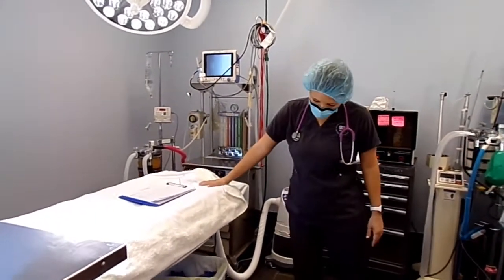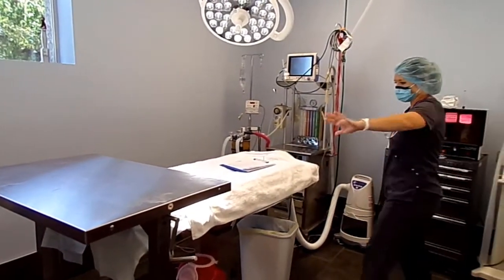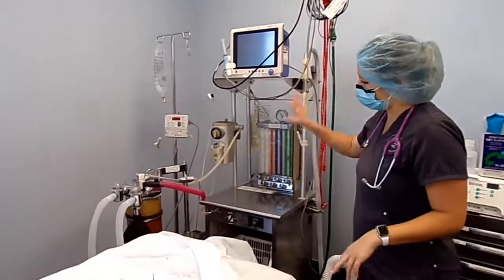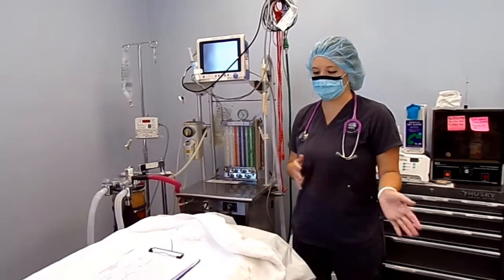Here's our surgical table, and this is where the surgeon puts all their instruments. The patient lays here. We have a nice little bear hugger to keep them warm. And then this is our anesthetic machine. We like to get everything set up and prepped before we ever even bring the patient inside.